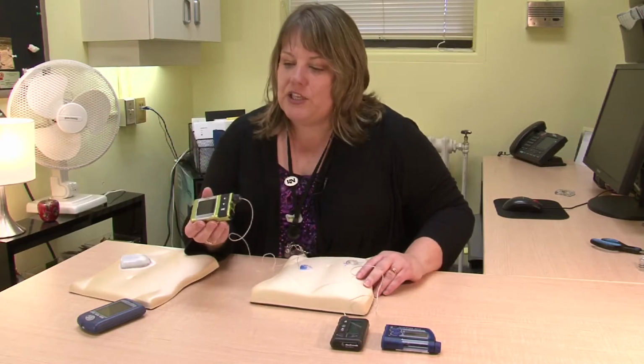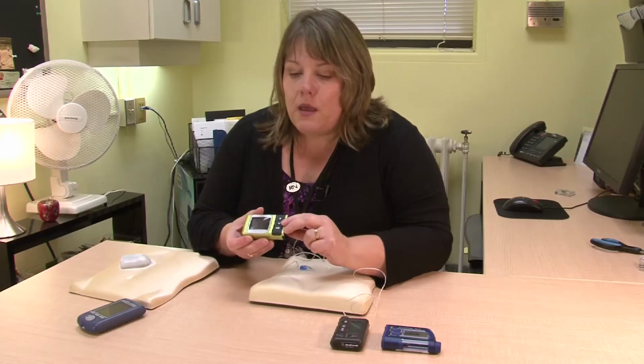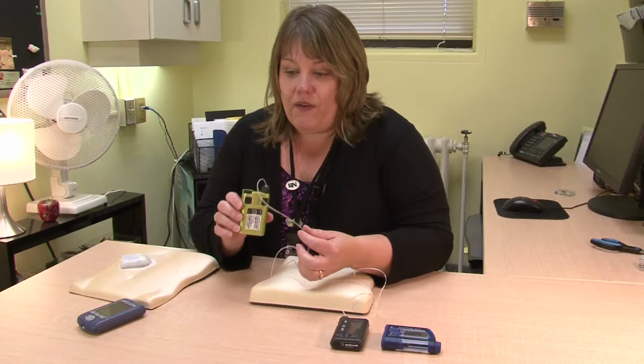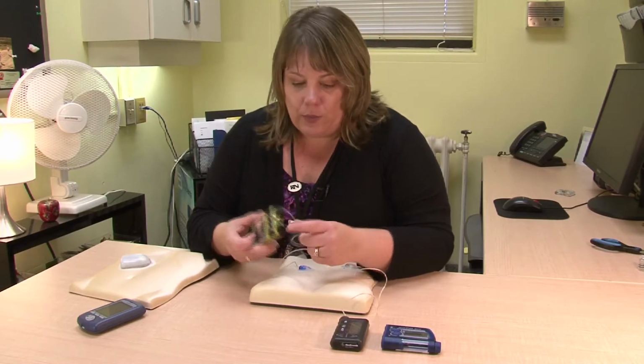So this would be attached to the person, could be attached in a number of different places. A lot of times people may wear them on their belt, may wear them in their pocket. Sometimes people have special belts that are made that it clips onto, and you may find it on their back. A lot of times for ladies, they wear it in their bra. So it might be in their bra, it might be on the side of their bra. So there can be all kinds of inventive places where you would find this one.